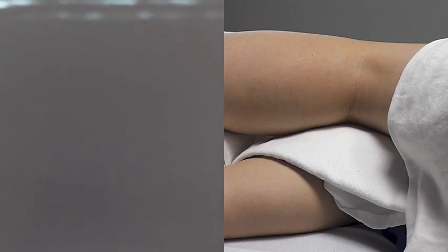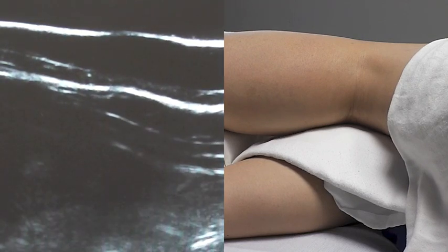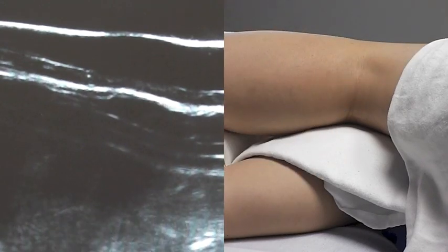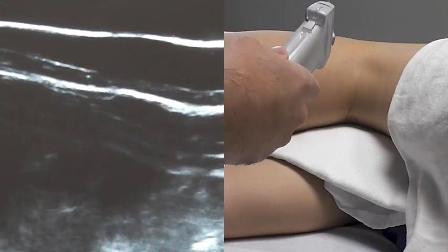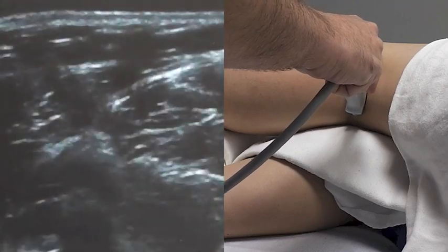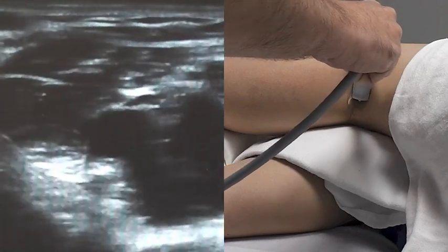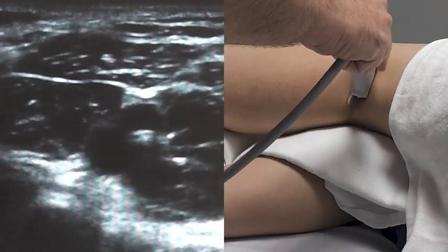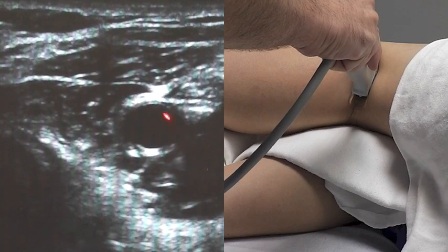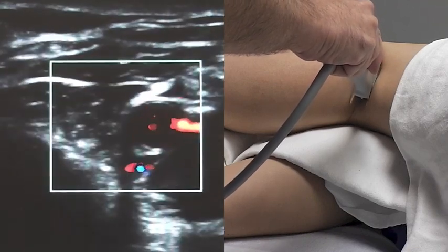It's very important when doing this block to make sure that you understand the medial and lateral sides of the leg, and that you don't make the mistake of thinking that this dot corresponds to the dot on the probe that you can see here — in fact, the orientation is reversed. I'm going to place the probe right in the popliteal fossa. The first structures I'm interested in finding are the vessels that traverse this space. As you look here on the screen, you can see what look like the vessels in the popliteal fossa. You can confirm that by hitting color on your probe, and we've now confirmed that we have flow through these structures.